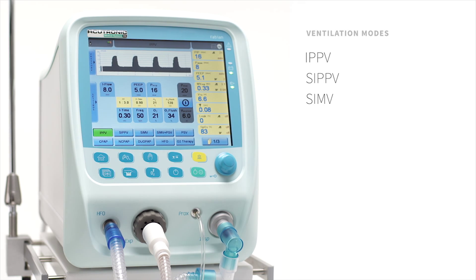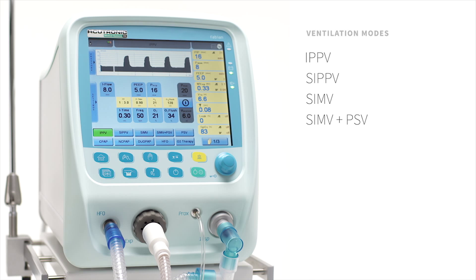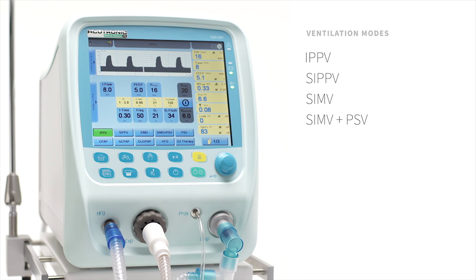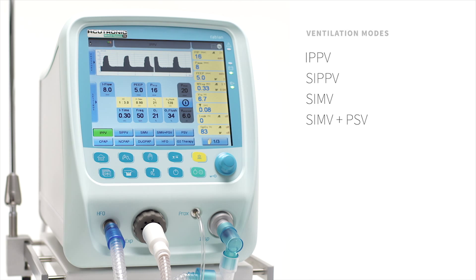SIMV, Synchronized Intermittent Mandatory Ventilation. SIMV plus PSV combines SIMV and PSV. This is the same as SIMV but the spontaneous breaths in between the SIMV strokes are supported and are flow cycled instead of time cycled.